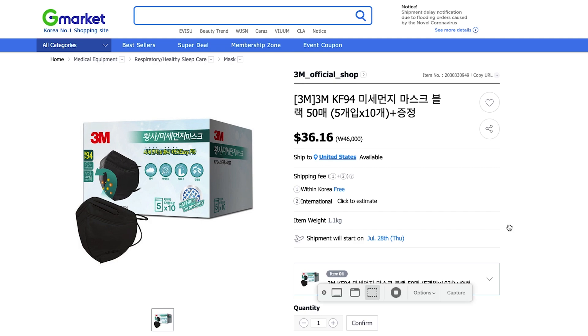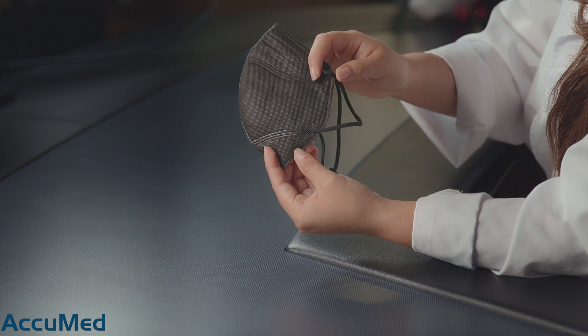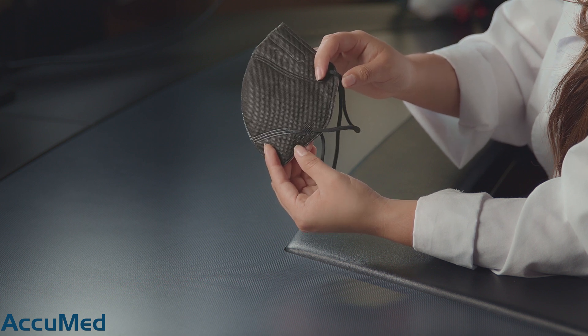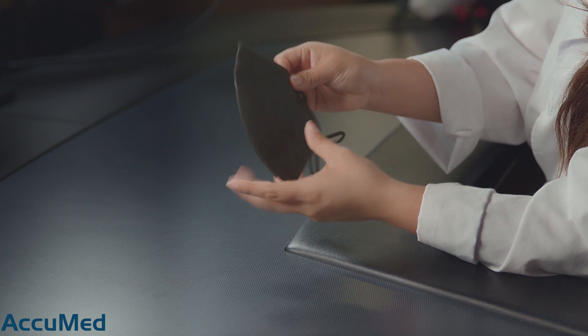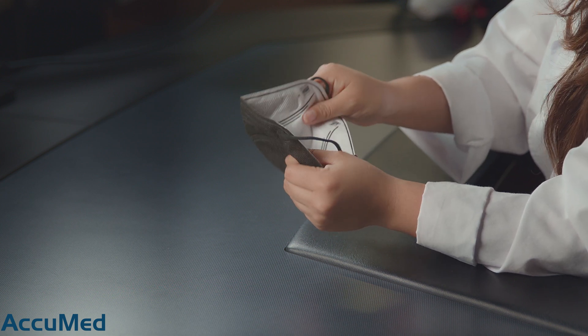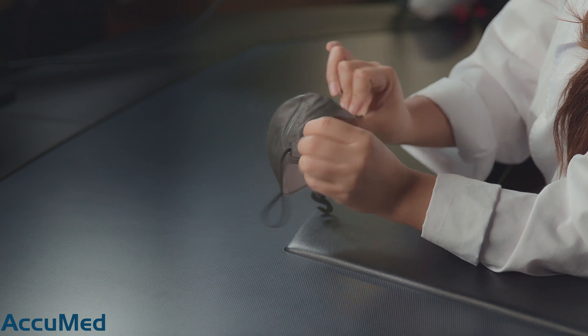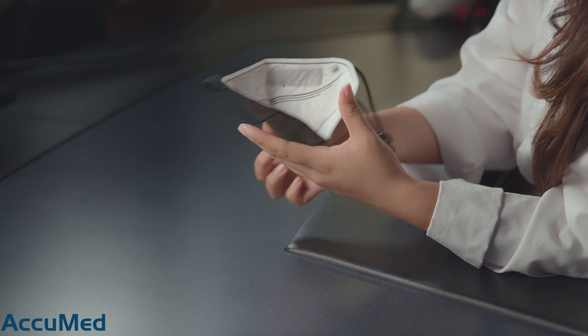Most if not all of the writing on the packaging and on the listing is in Korean. In terms of logos, it only has the 3M logo. The material is a little rough, but this is the first time we see a mask have the nose foam inside of the mask. They're also very thin, but most KF94s that we've tested are thin.